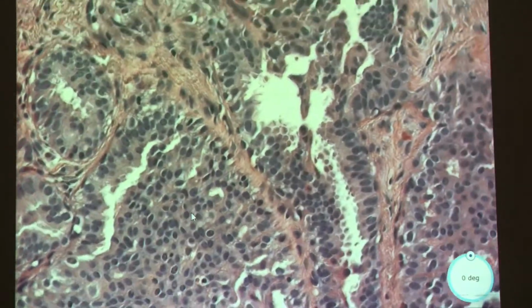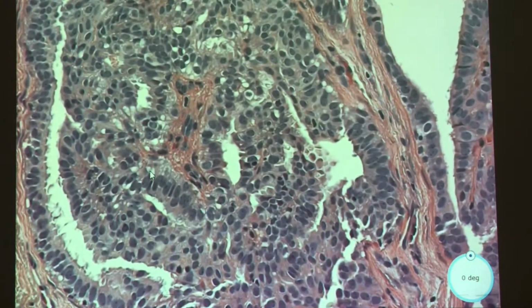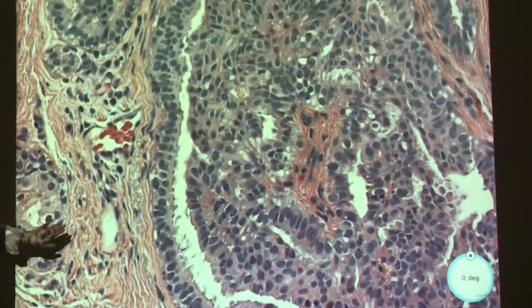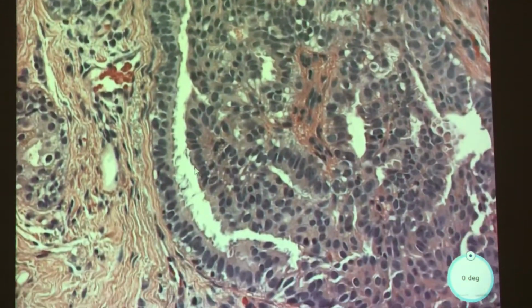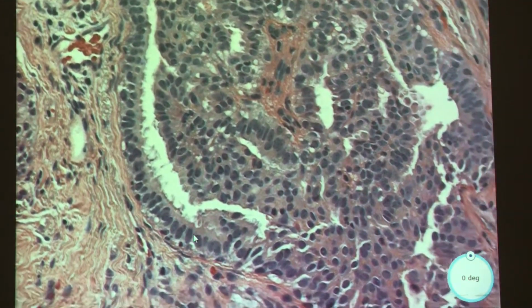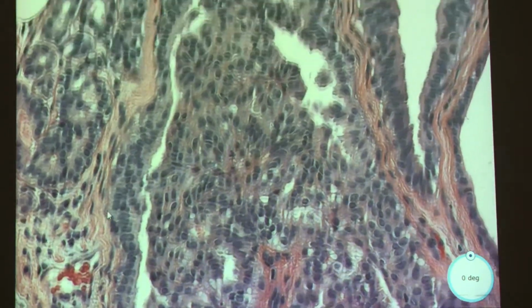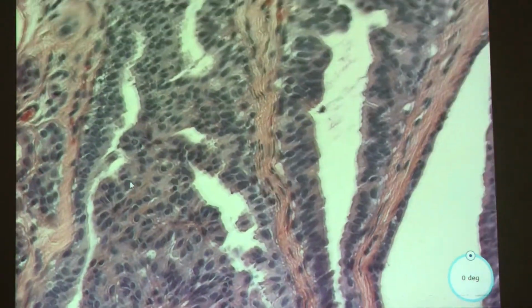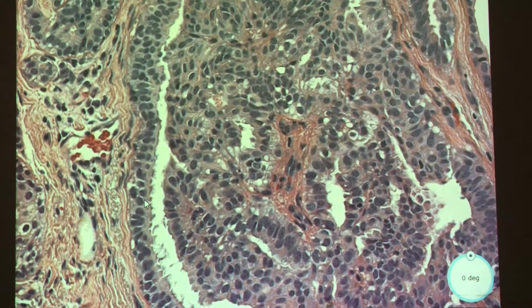And there's maybe some areas that are a little less complex that'll give you a hint as to what you're looking at. Like maybe more of this stuff. These things are a little less crowded and more uniform, I guess, compared to the previous one. So, judging from what we were going over previously, I would say this is atypical for a breast. Well, maybe? It's still okay.